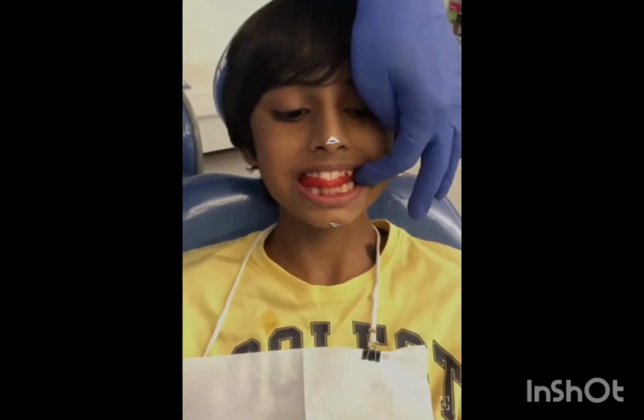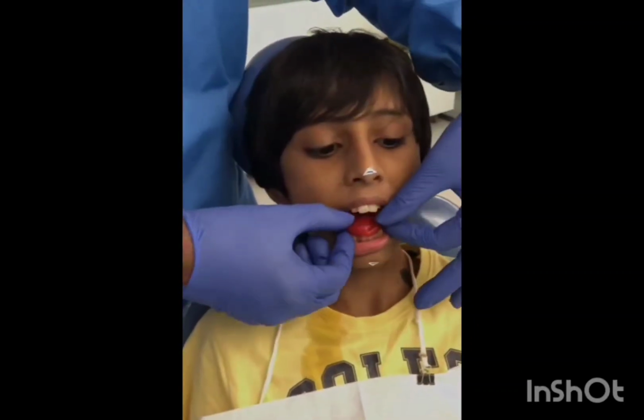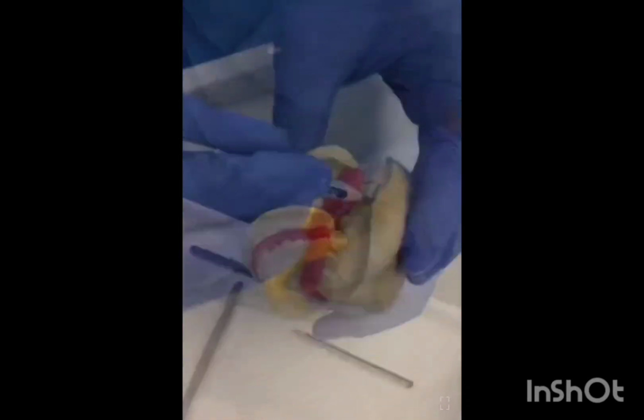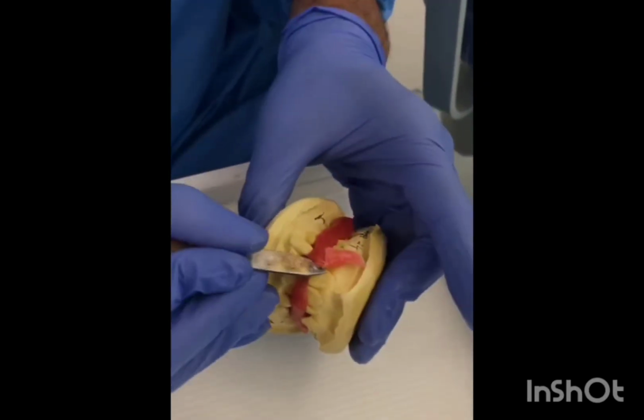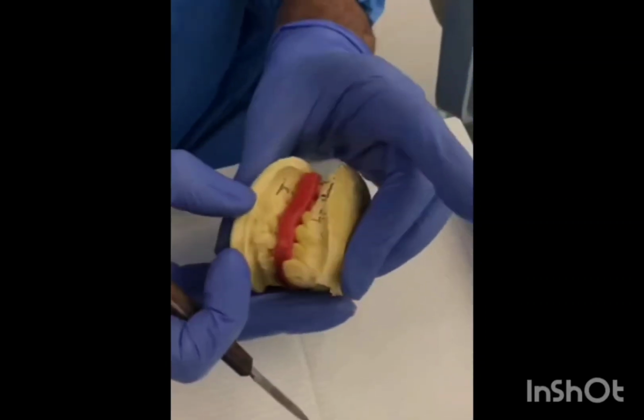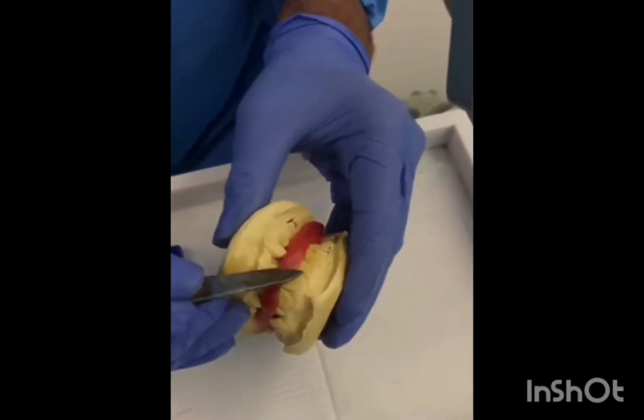He made sure that the vertical opening and the measurement were accurate. Then the wax bite is tried on the cast. If satisfied with it, we trim off the excess, and that is how it is done. Hope it is clear now.